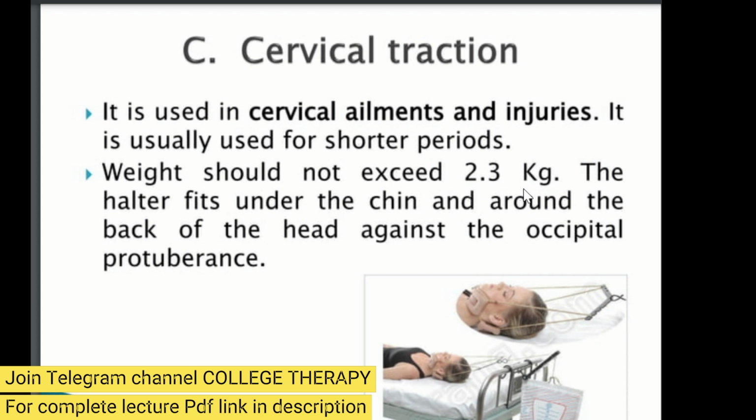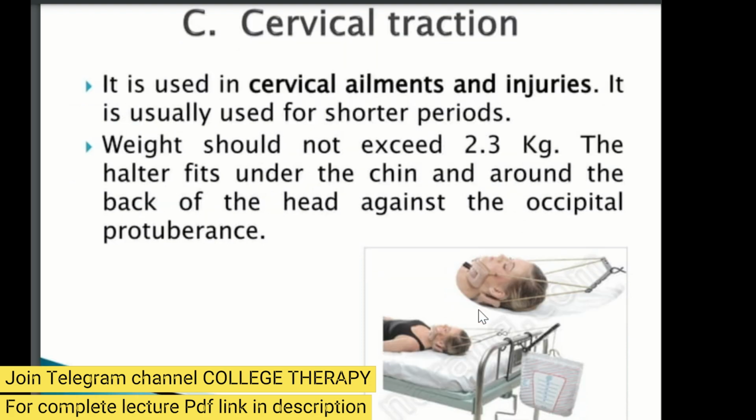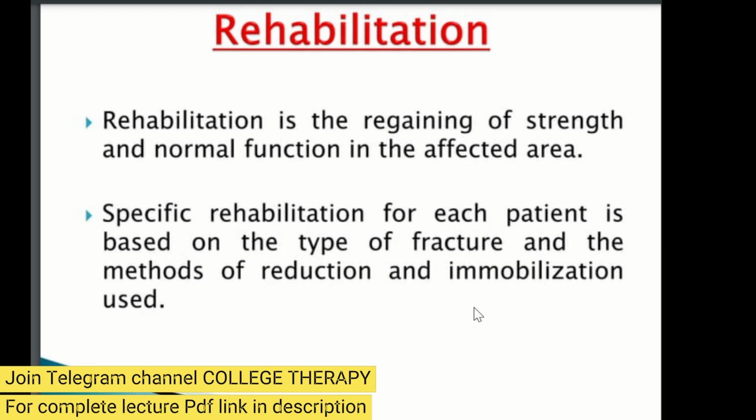So you have to take precautions for that. The halter fits under the chin and around the back of the head against the occipital protuberance, that you see here. You can fix the halter. This is the rehab part.